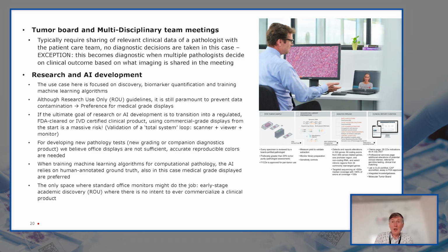There is an exception, however. There might be some MDTs where you have multiple pathologists, again, comparing and looking at images, where it could make sense to also look for medical grade displays. But the normal use case there is really non-diagnostic.